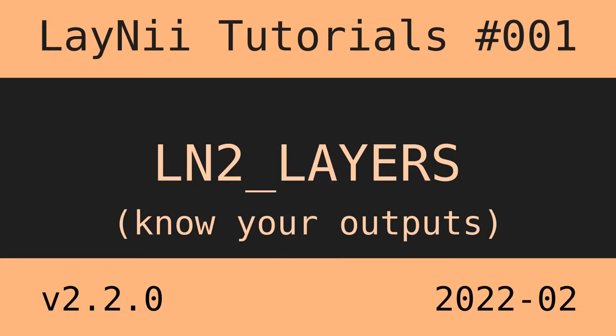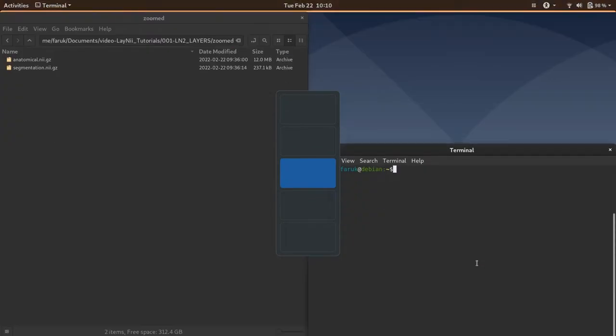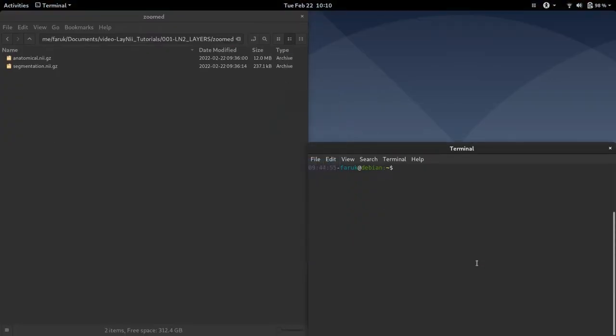Did you know that in Laney you can get more than layers? Now let's have a look at an example case.